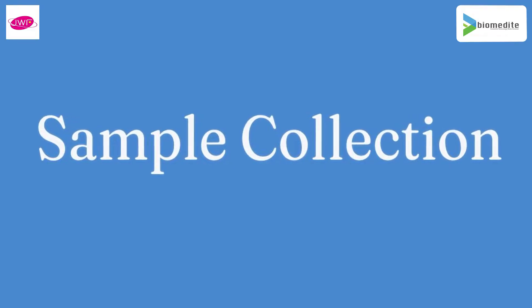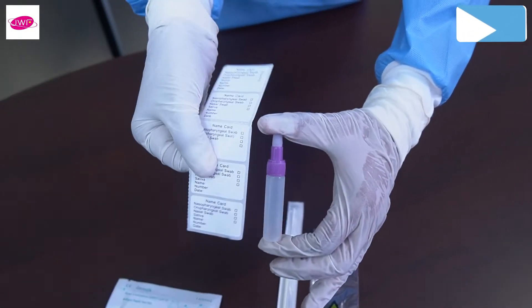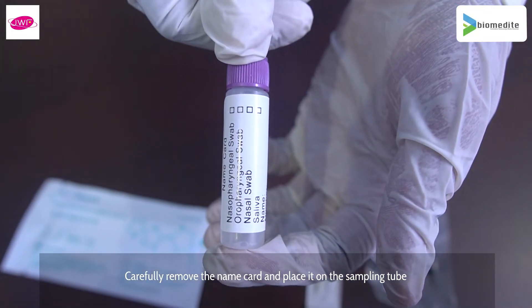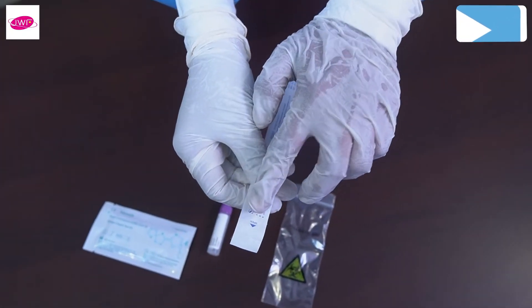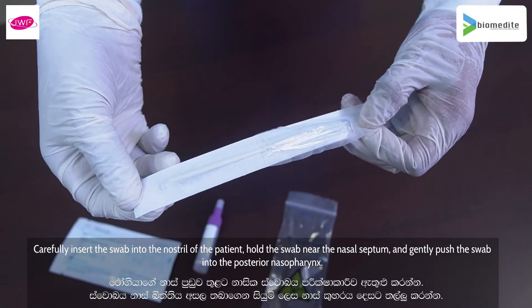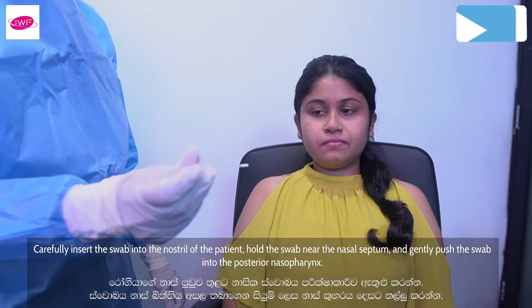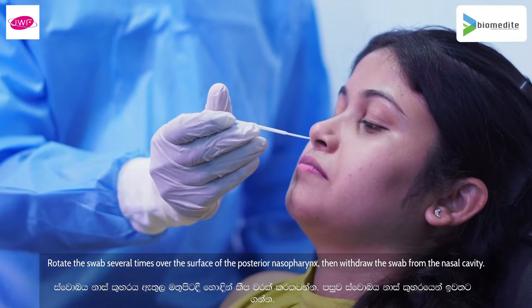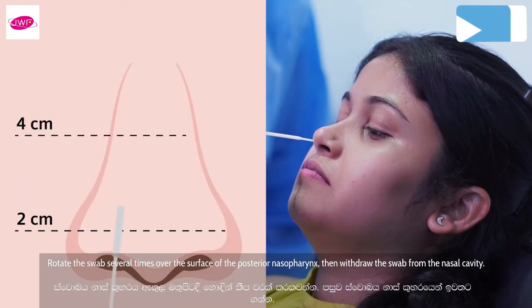Sample collection: carefully remove the name card and place it on the sampling tube. Carefully insert the swab into the nostril of the patient, hold the swab near the nasal septum, and gently push the swab into the posterior nasopharynx. Rotate the swab several times over the surface of the posterior nasopharynx, then withdraw the swab from the nasal cavity.